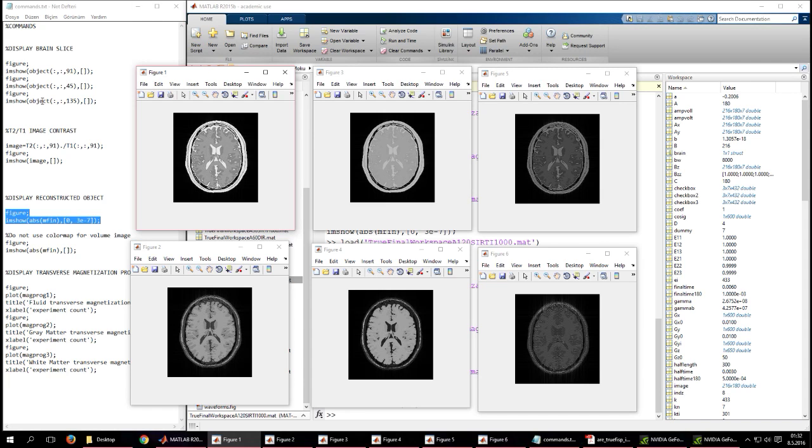Low flip angle excitation pulse sequences give us very low contrast between the gray matter and white matter, and high flip angle excitation pulses cause the signal intensity to diminish. And when the single inversion recovery is used with the same excitation pulse sequences, it causes the fluid tissue, which has very long relaxation time, to appear very dark.